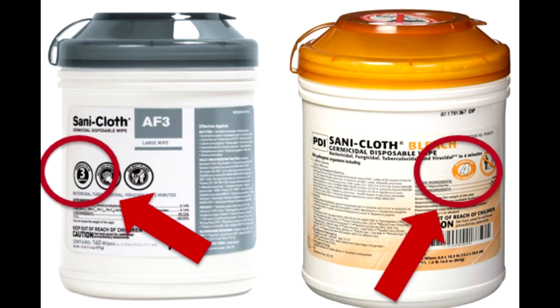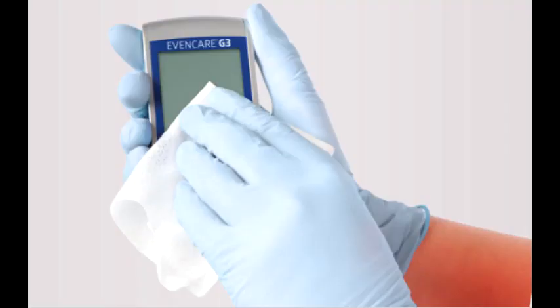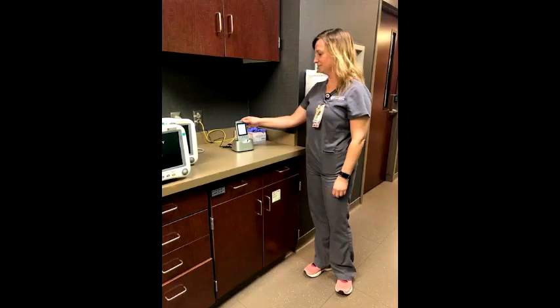Equipment, like a glucometer, is cleaned with the orange top PDI bleach wipes and requires a 4-minute wet time. When the gray top AF3 wipes are used to disinfect other items, a 3-minute wet time is required. Remember, the patient room is always considered a dirty zone, and the hallways are considered a clean zone. Always wipe items at the point of use and transport clean. PPE should not be worn in the hallway to transport items that have been low-level disinfected.